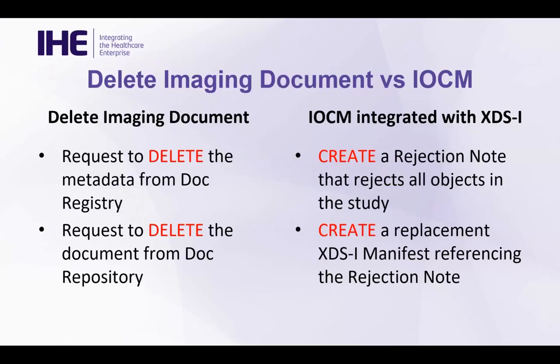So now with XDS-I integration, there are two similar paths, using this new delete imaging document option, or IOCM. I want to highlight the differences between these two options. With the delete imaging document option, the new option that we introduced recently, as I mentioned earlier, both the metadata and the document will be deleted.